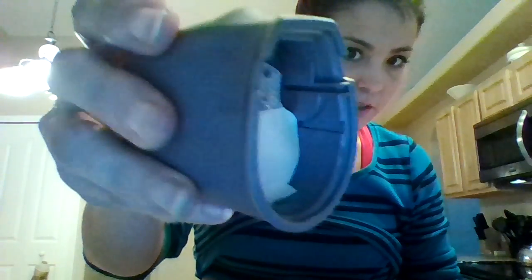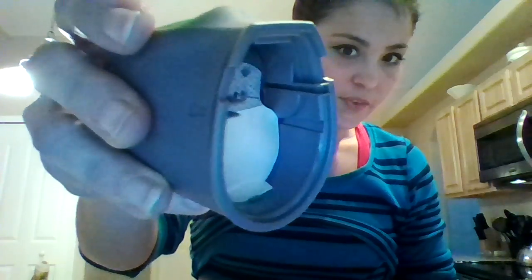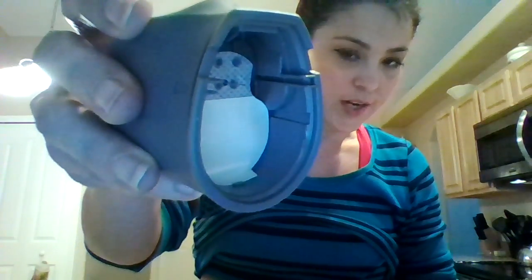Now the sensor is loaded in here. I'm going to pull that back up so you don't stare at my belly button the whole time. And the needle, I don't know if you can see, there's the needle. That's the needle that's going to shoot that into me. And right now it's like already triggered. It's cocked. It's in position. It's ready to go. So let me scoot this back down just a little bit again so you can see me do this. Okay.